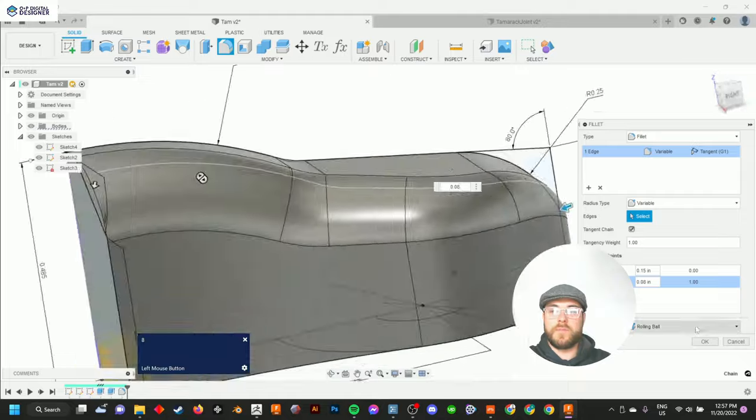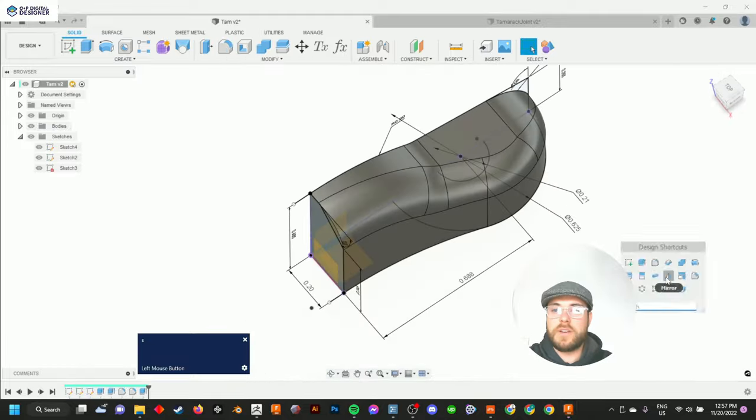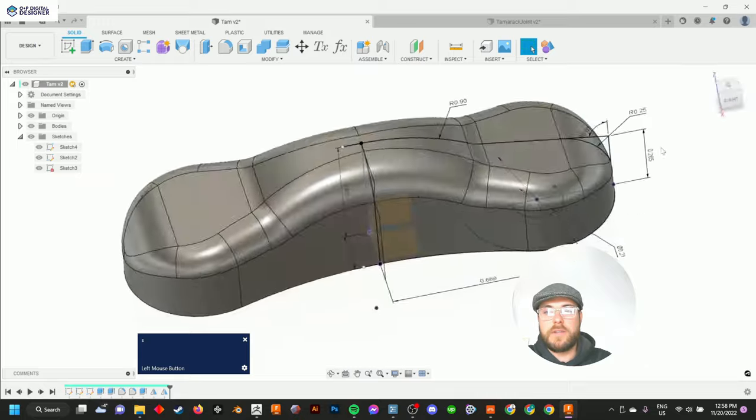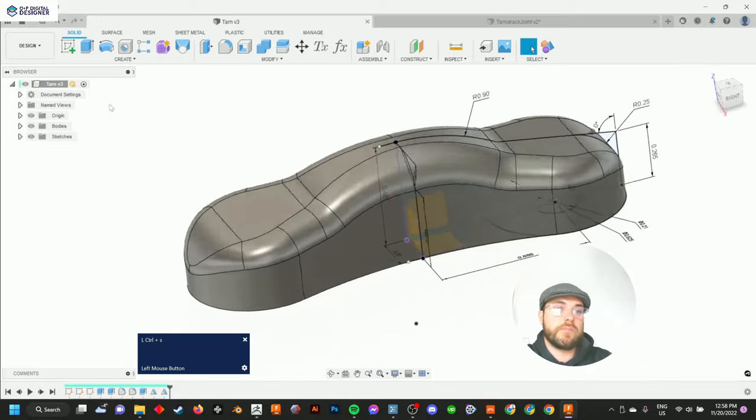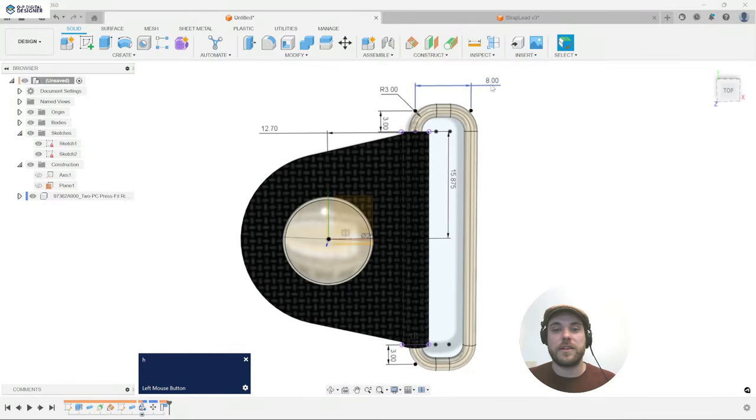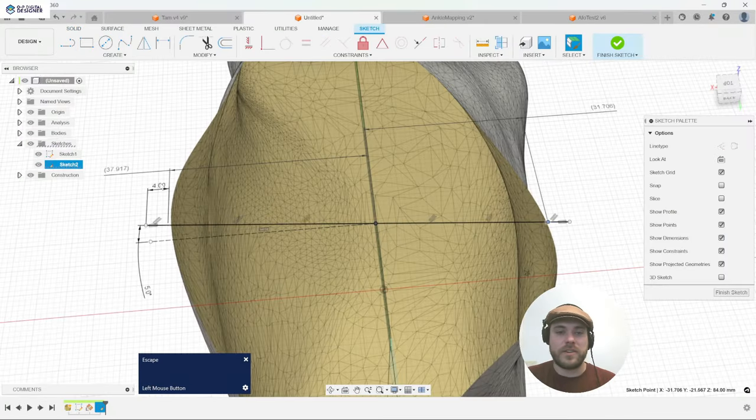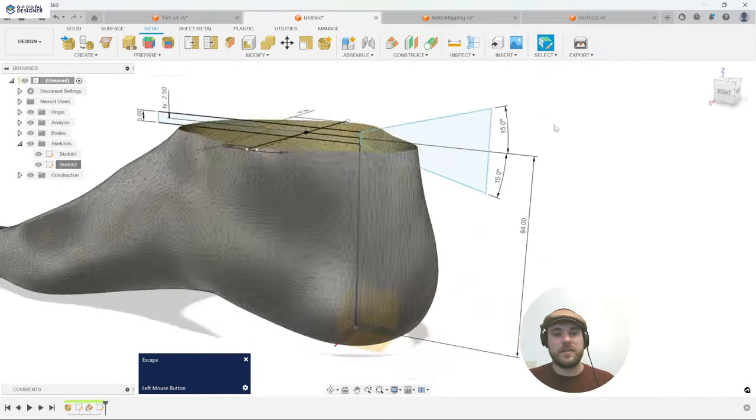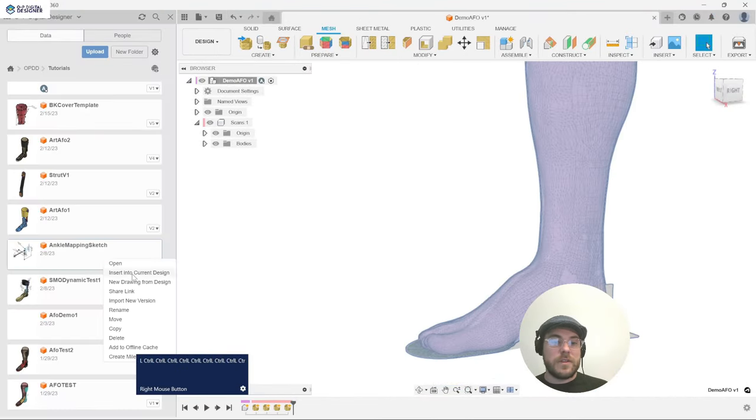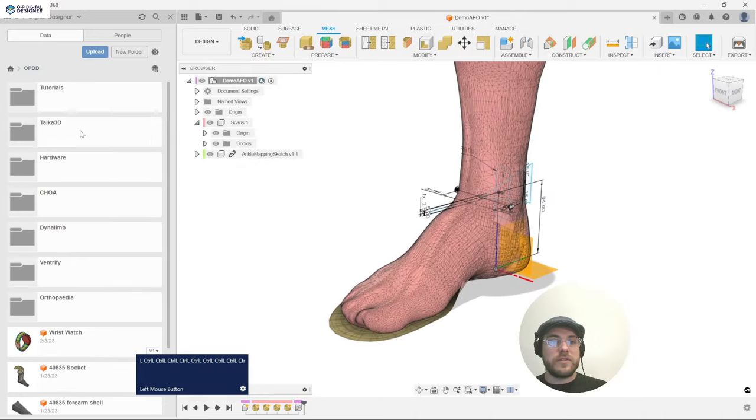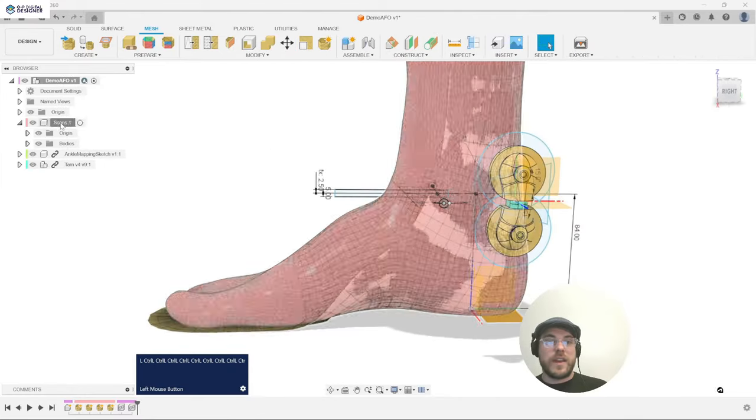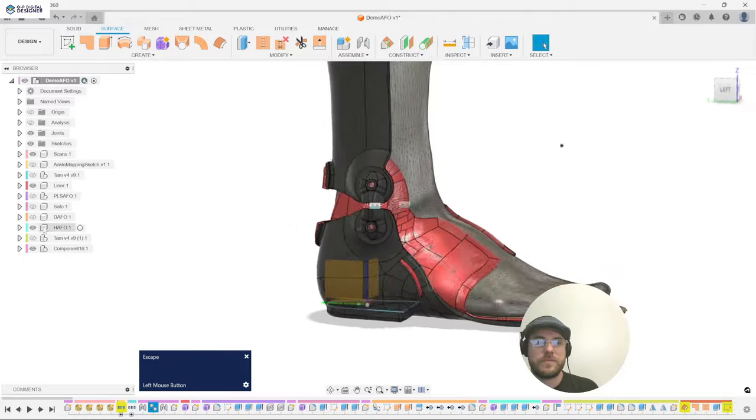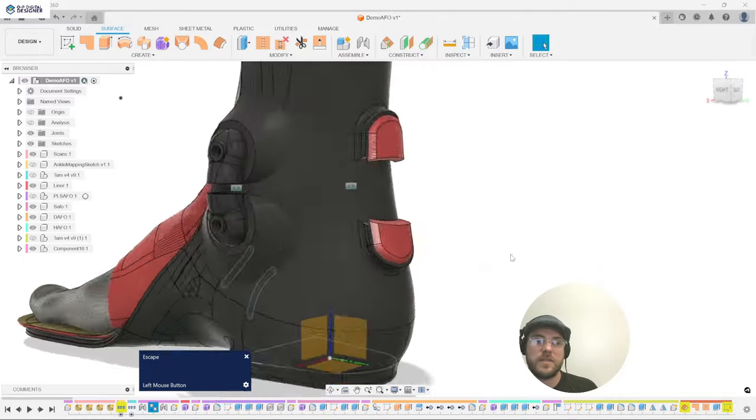We then go straight into Fusion 360 and start building out template files for each of the main components and features that we will want to build in every patient case we work on. Things like tamarack joints, or a strap lead, or an ankle mapping sketch file, thus ensuring repeatability. Each product will be taken through from the absolute beginning to a mesh that can be imported into a product design software for CAD design and 3D printing, with standardized workflows that apply again and again so you understand the implementation.